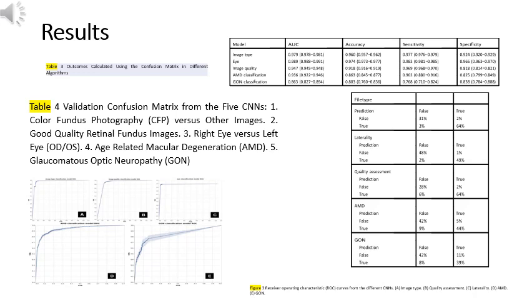The first cause of misclassification of images in the AMD and the GON algorithm was the presence of borderline cases. In the case of AMD, false negatives were early AMD that was not seen by the CNN as disease. False positives were cases of small drusen in the macular area that were not tagged as AMD by the retinal specialist. False negatives and positives in suspected glaucoma were borderline cases with approximately 7/10 vertical excavation.